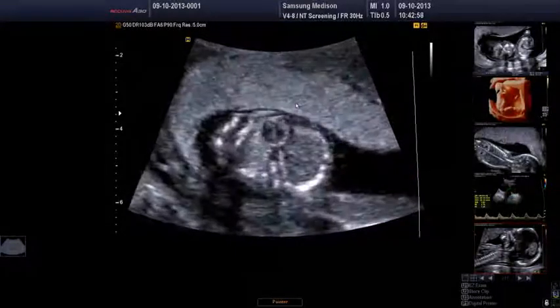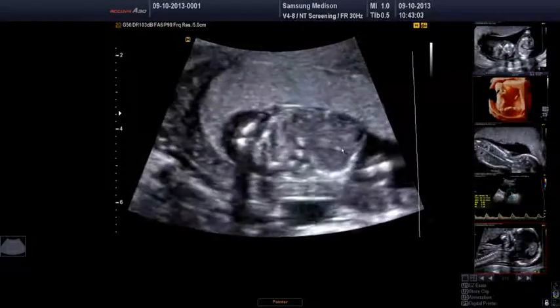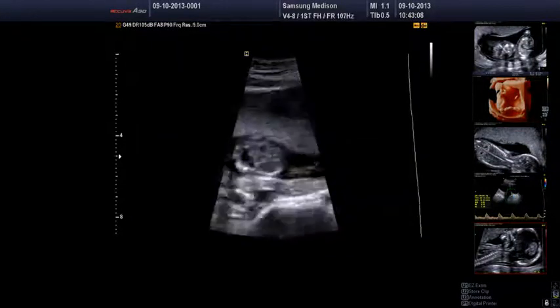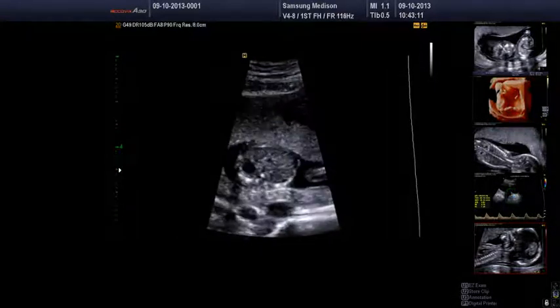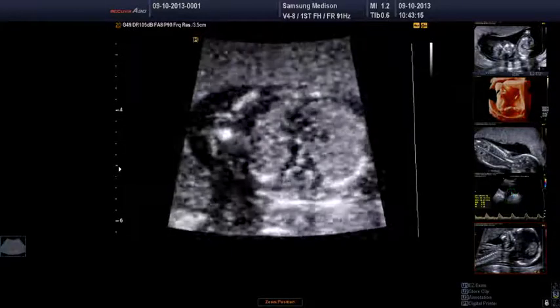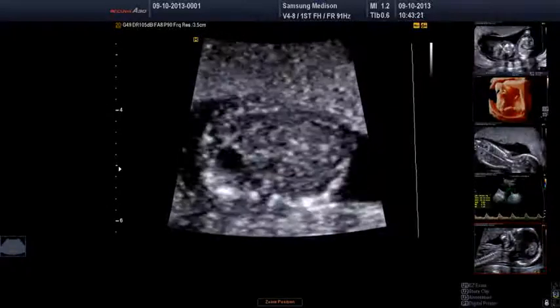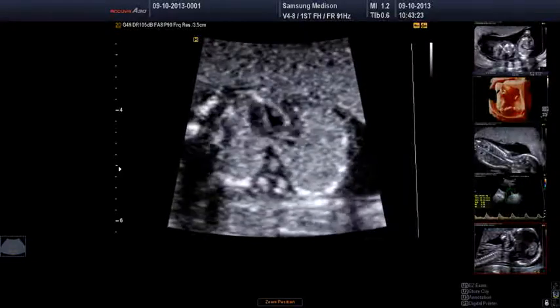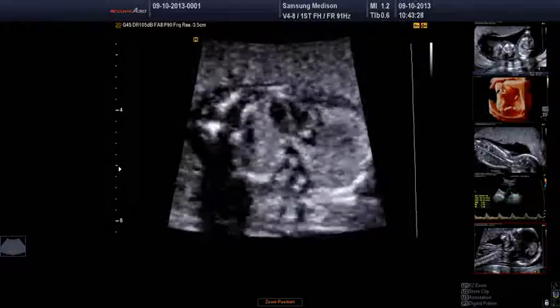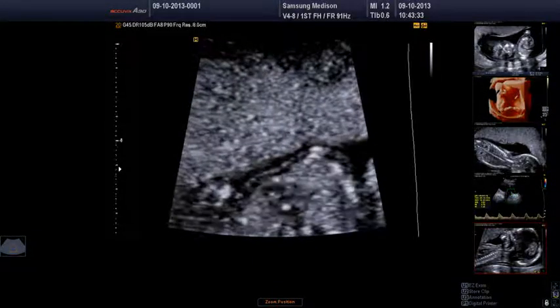And as we come down further, coming into the chest now, we're just going to change the setting on the machine. Okay, so just starting below the heart here, so just a reference point, you can see where the stomach is, below the diaphragm on the left-hand side. So we can see that we have a biventricular system, and, sorry, can you just reposition that?